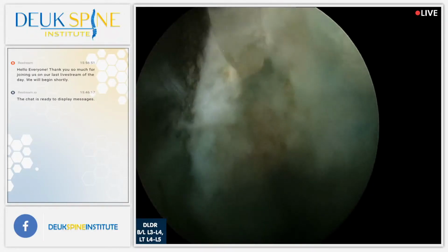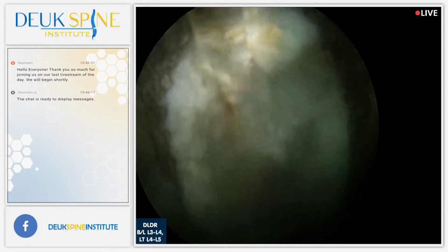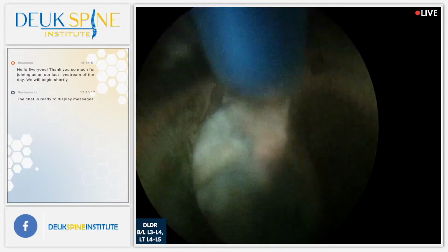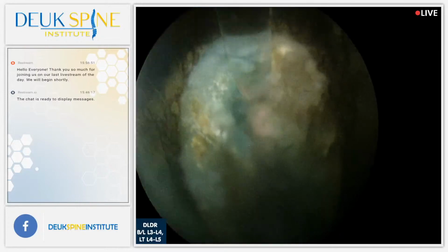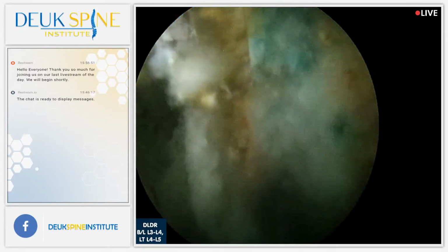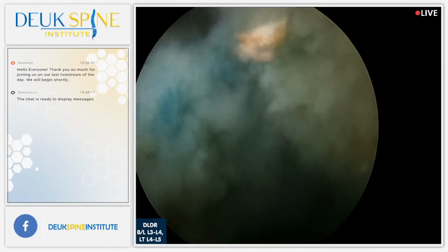Yeah, endoscopic piriformis, with this scope right here. It's going to be amazing. I'd probably be the one to do it, using this laser right here, just release the tendon. It'll take me 10 minutes. It's about like carpal tunnel. Prone, laying on their belly. 10 minutes, sedation, propofol. I mean, literally plant a needle. Probably using x-ray for me, not ultrasound. Patel likes ultrasound.